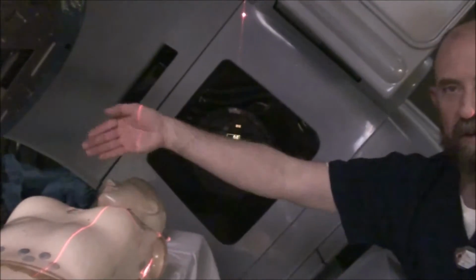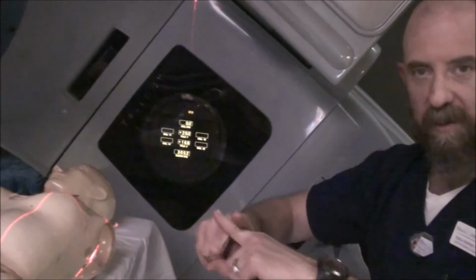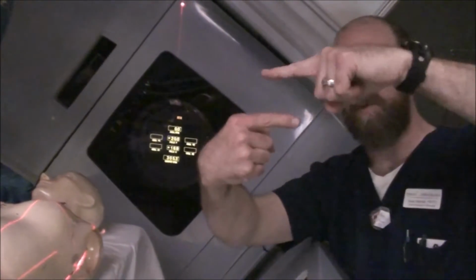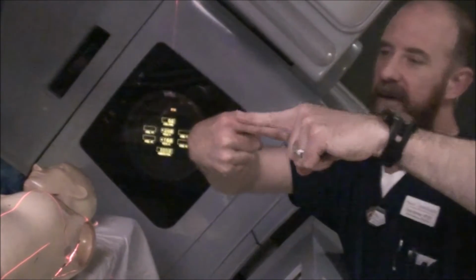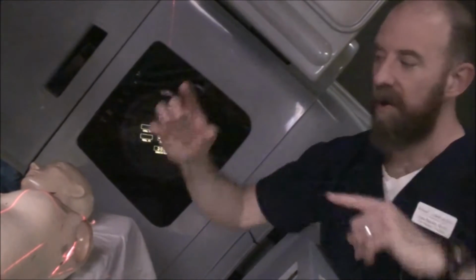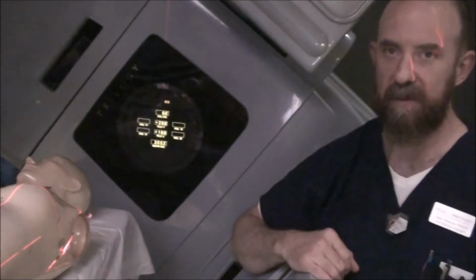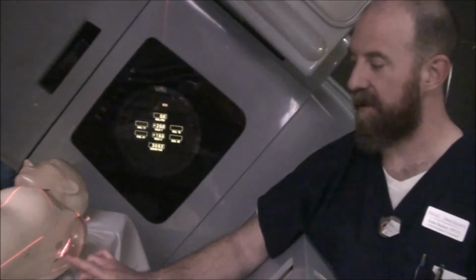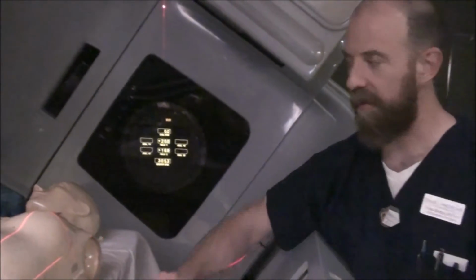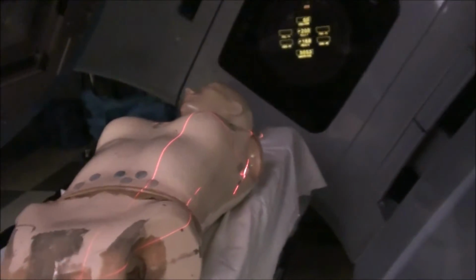You don't know exactly what your gantry angle absolutely has to be to radiographically show where these 2 wires will cross. If you don't have the correct angle, the wires will not overlap one another. And then you rotate the gantry until they superimpose on one another. Once they're superimposed, you know you're parallel opposed at the doctor's marks. That's the important thing, because the doctor wants to treat to a specific depth. He wants to treat a specific amount of tissue. So you're going to use these wires to radiographically show, do I have the gantry angled correctly?